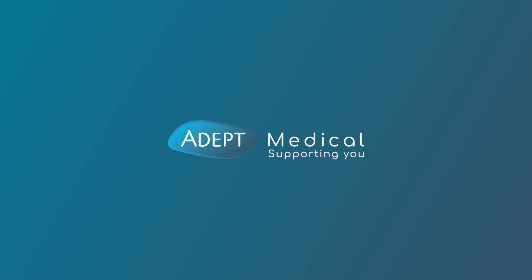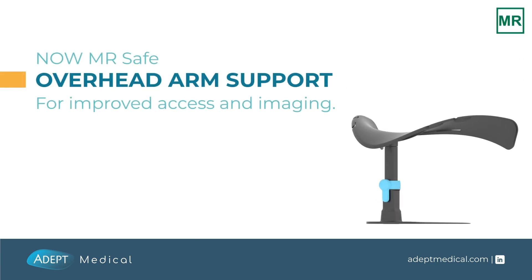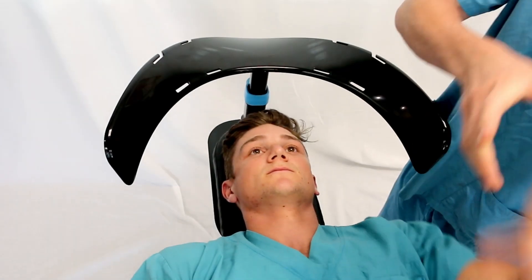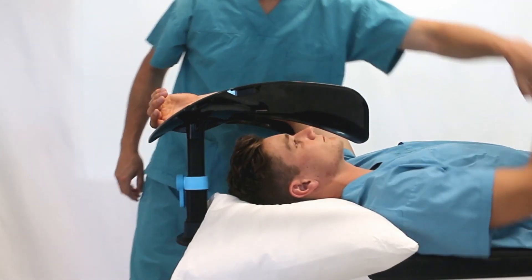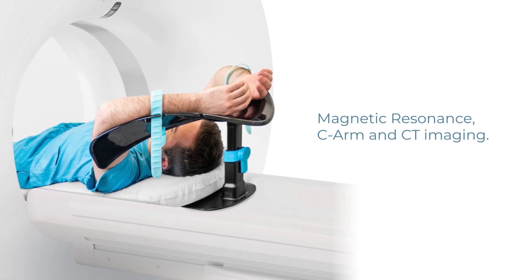Adept Medical introduces the overhead arm support, designed to comfortably support the patient's arms. It eliminates extreme shoulder flexion, allows abdominal access, and removes unwanted artifact, providing the ideal solution for patient positioning and management during magnetic resonance and CT imaging.